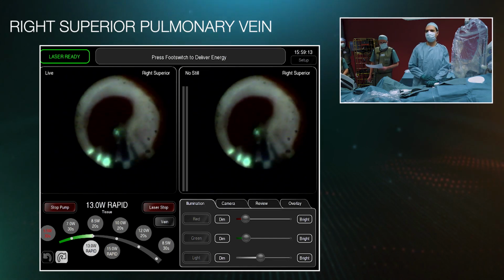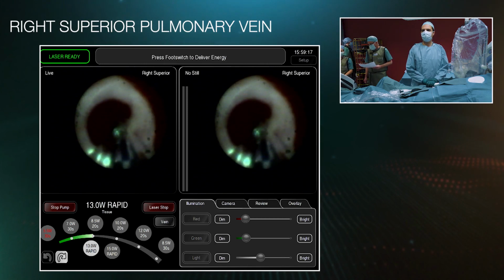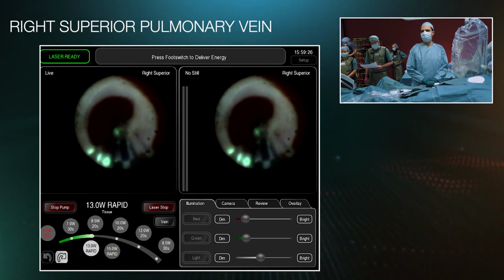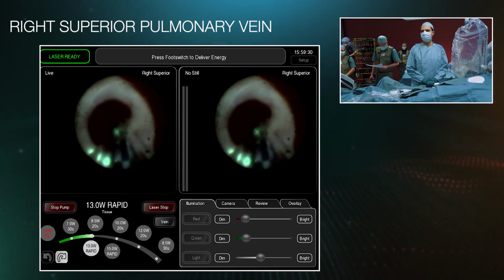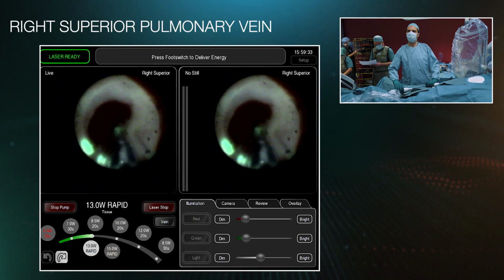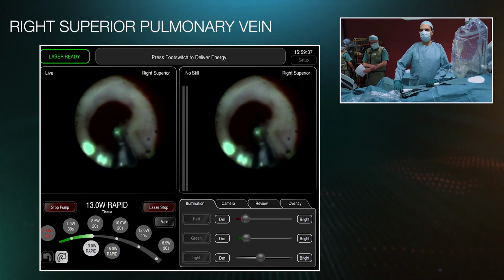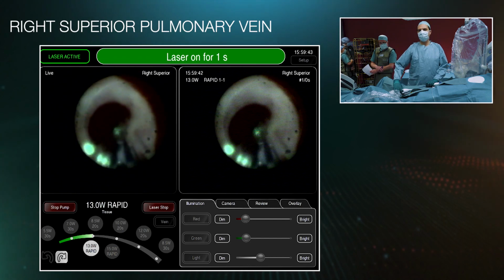If you look at the red line of blood at the edge of the endoscope from 12 o'clock to 5 o'clock, not the vessel itself, but the blood pool further out, you can appreciate that it moves at a rate of 1 per second, which is the phrenic nerve pacing rate. It's a diaphragmatic contraction we're visually confirming, which means I won't have to put my hand on the diaphragm to know that we still have capture. I'm starting the ablation here.